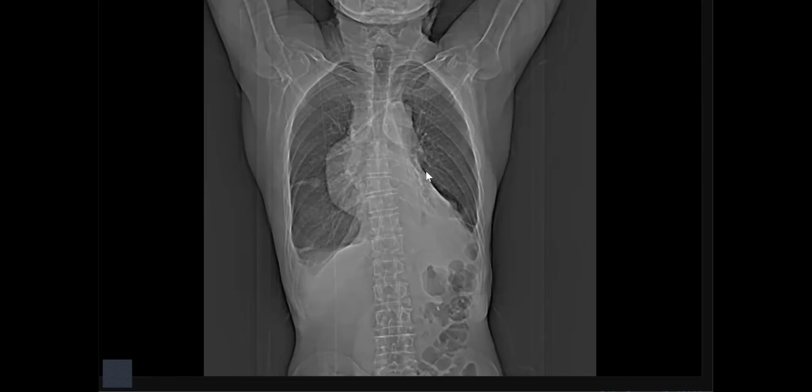But please take care about the given history. You remember the history? Yes, sir. The patient has dialysis. After dialysis, some chest pain and dyspnea. So, sir, we are looking for an acute insult, so not just a mass, okay?